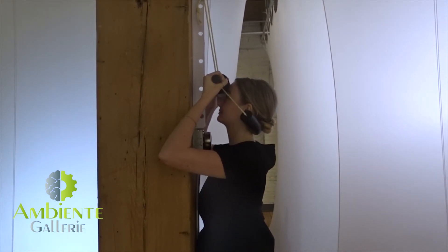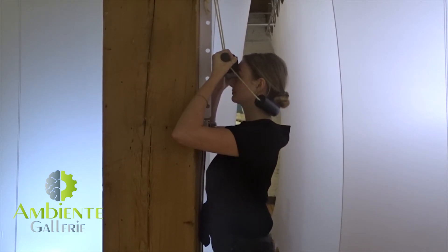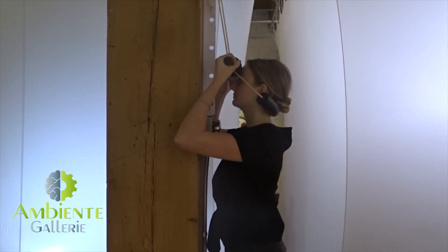Ups and downs — about a three-second hold at the bottom, then slowly rise up. We're going to work our way up to doing 20 ups and downs per day, always to comfort.